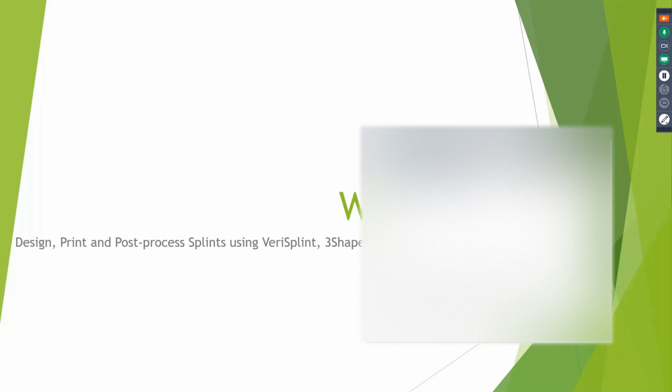Using the recommended curing protocol with the auto flash. From Megan: she's using both the key splint and the VeriSPLINT resins, and she's noticing the inside can get, quote unquote, gummy when steam cleaned. Is there a reason for this, and how to avoid the gumminess? And it's happening on both resins and when trimming and adjusting the fit if it needs it.